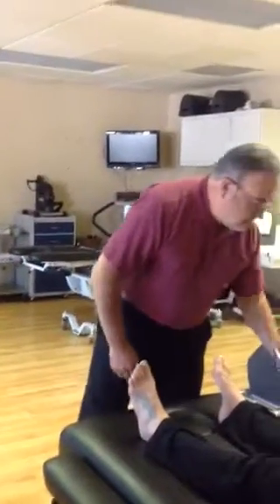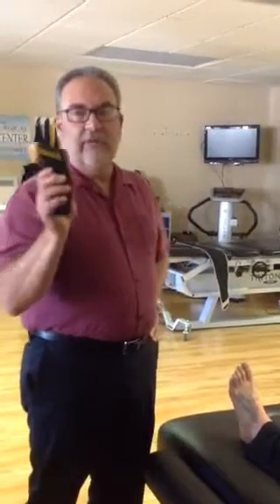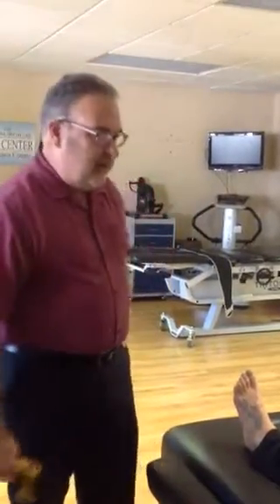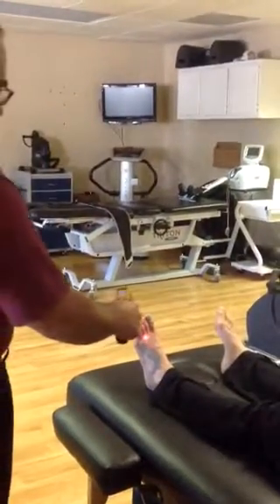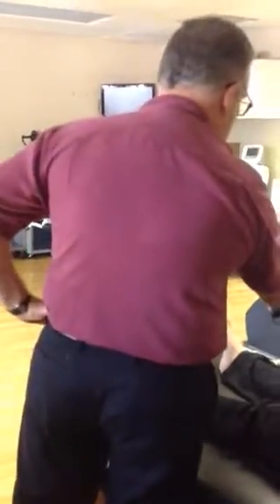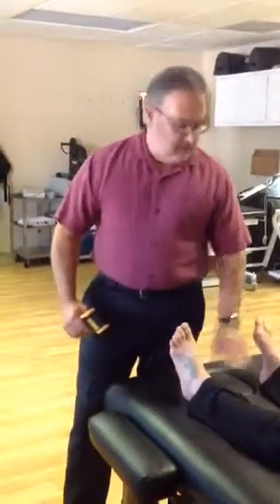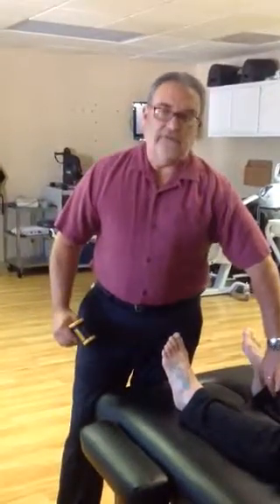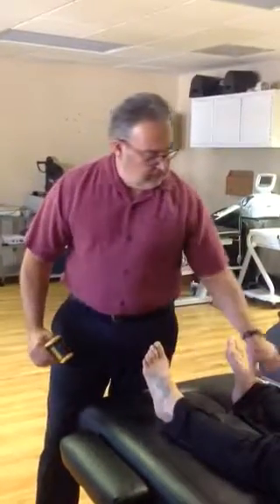Then in my office I measure temperature and arterial flow using an infrared thermometer. I put it on their foot and get a reading, then compare to the other side to make sure they're getting good arterial and venous flow on both sides and that temperature is the same. I also palpate to check temperature and pulse, making sure there's a good strong pulse in the areas of the foot.